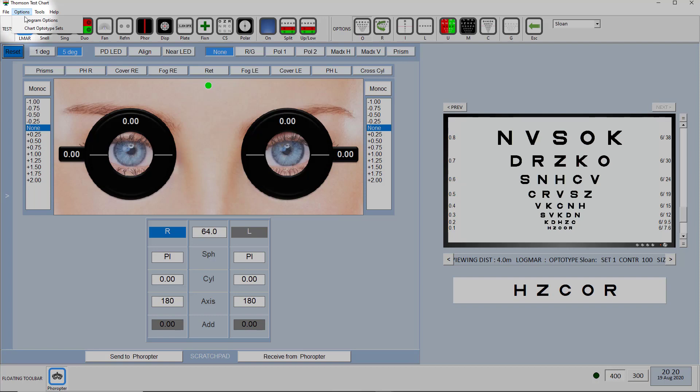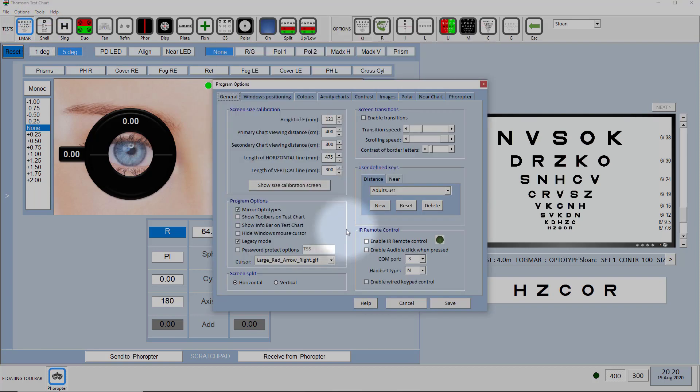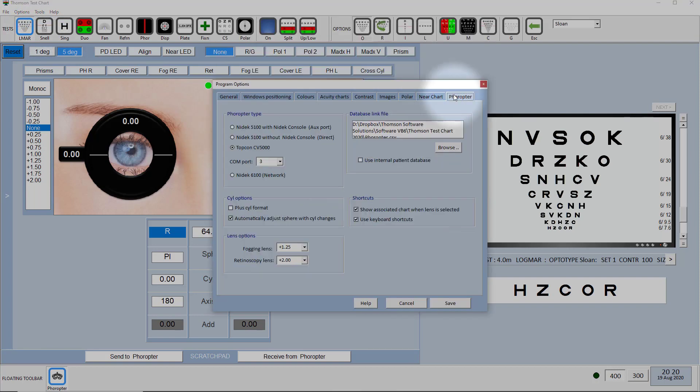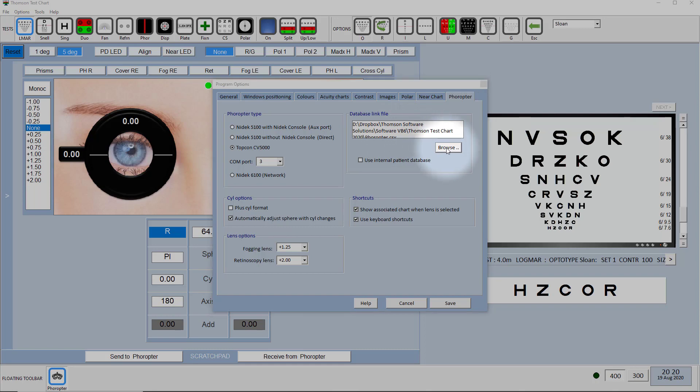To do that you select options, program options, and then go to the Phoropter tab and then you have to select this intermediate file using this database link file option here.